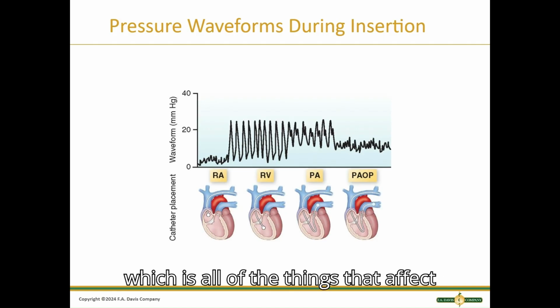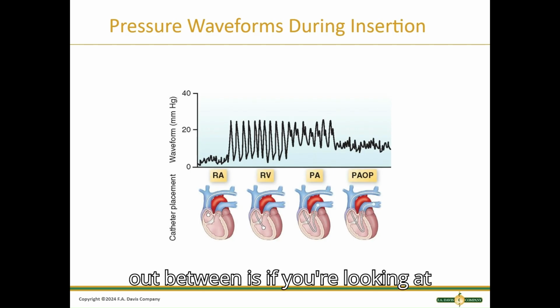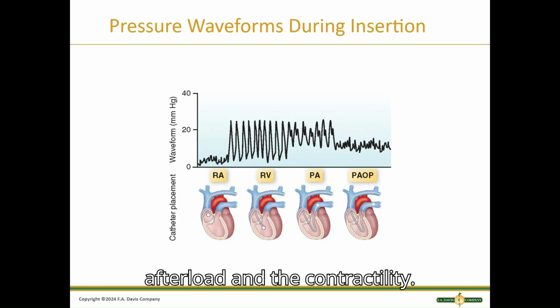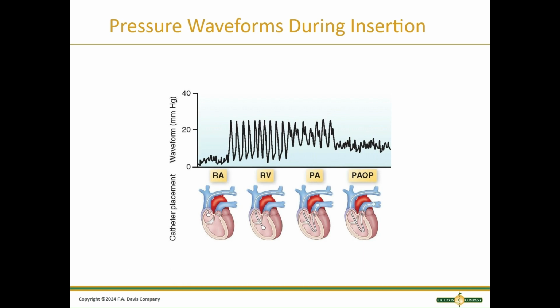So when we're looking at these pressures and doing this type of setting, we want to make sure that we are monitoring for any complications such as arrhythmia as we're floating this catheter through the heart. We want to monitor for any bleeding or any respiratory distress because, again, the risks include infection, pulmonary artery rupture, the arrhythmias, possible thrombosis, or an air embolism.